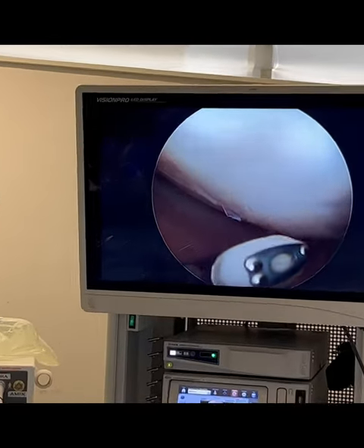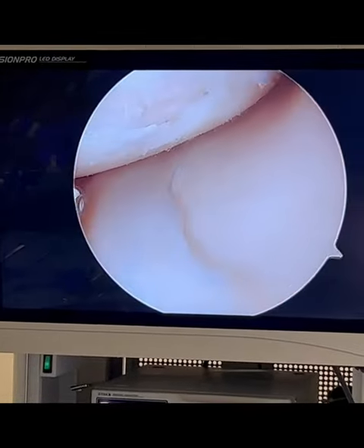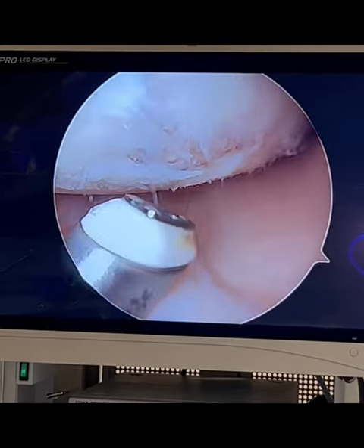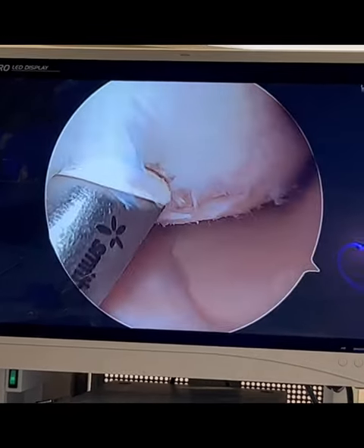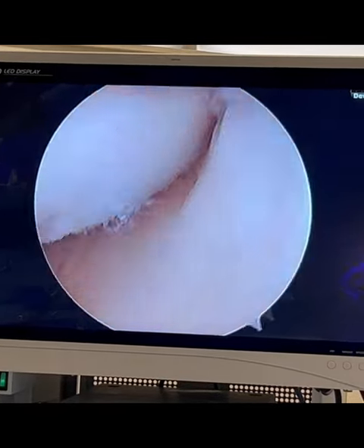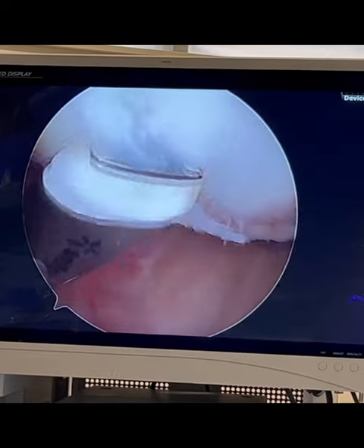This patient does have a cartilage tear, but it's not the typical meniscus cartilage. It's actually articular cartilage, and you can see it right here. This is the type of injury that will cause clicking, catching, pain, and swelling.